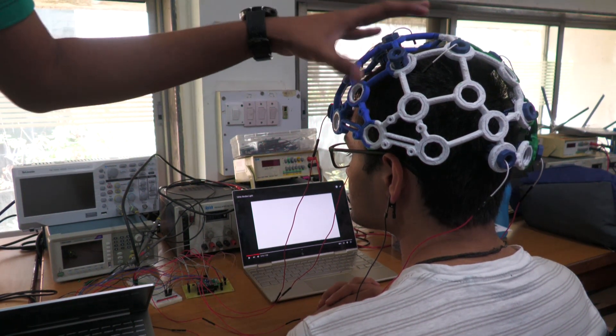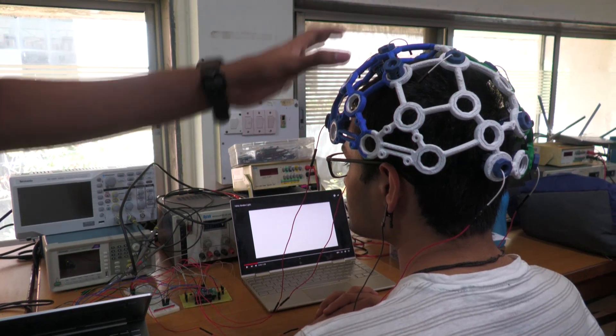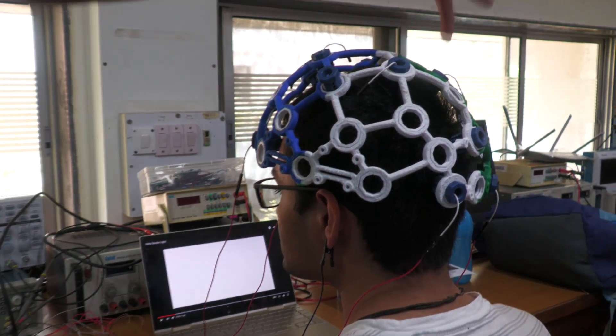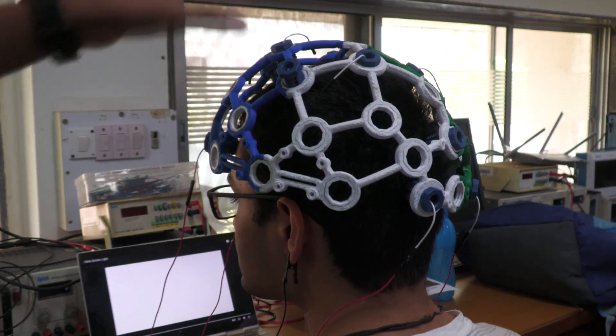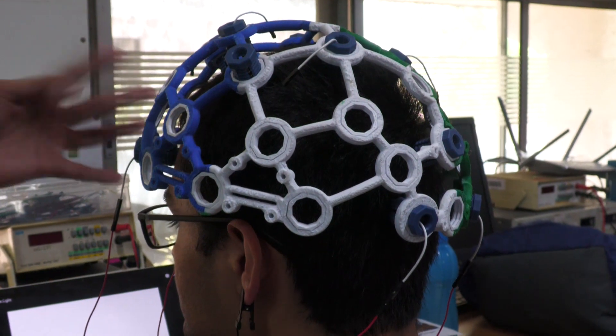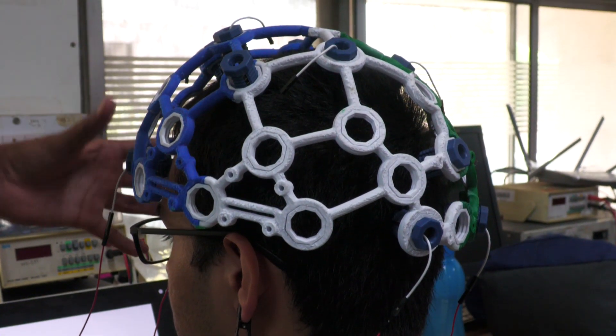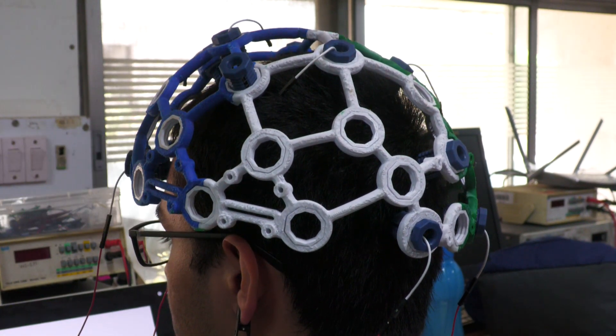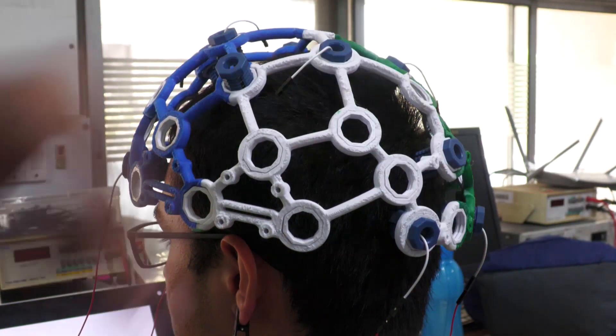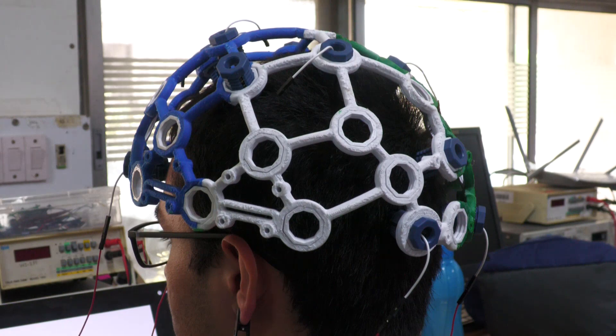So what we have over here is a 3D printed headgear where electrodes have been slotted in for acquiring the data. Currently we have attached four electrodes, two in the front and two in the back, and these electrodes provide the data to our circuit.